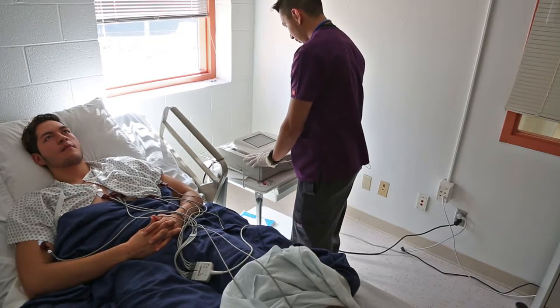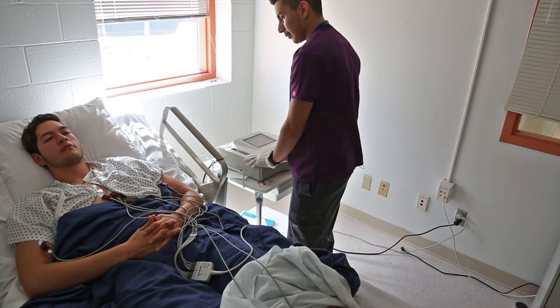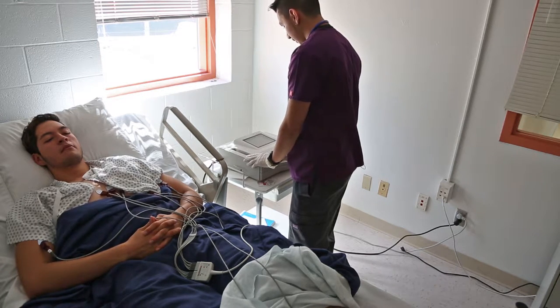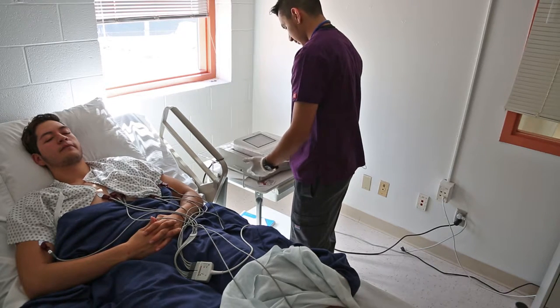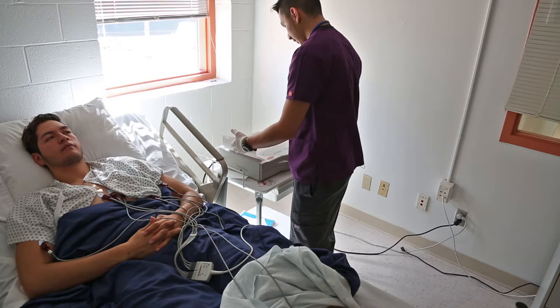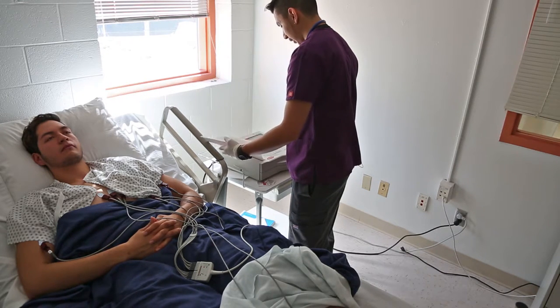Rolling up his leg one more time — red will go on his left side and green will be going on his right side. Once we have these all connected, we can go ahead and take a look at our machine. Make sure there's no artifact on your machine, no pulling on your wires, and keep your patient covered. We're going to run this test now. Sir, take a deep breath and stay as calm as possible. And we're running it — looking good.